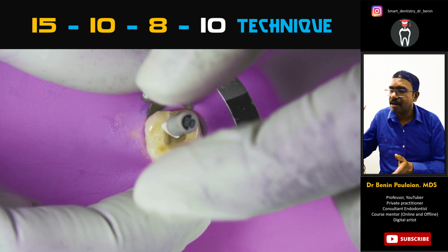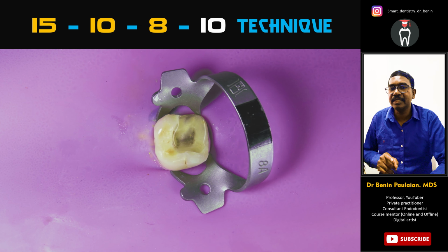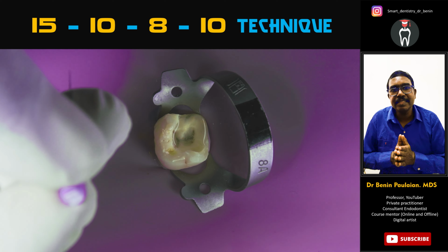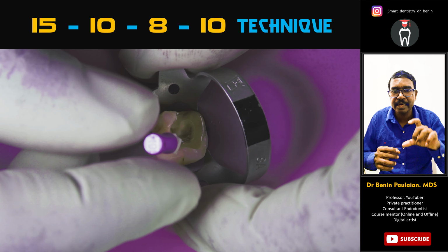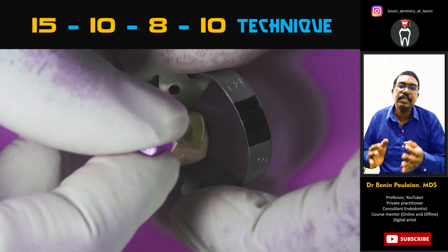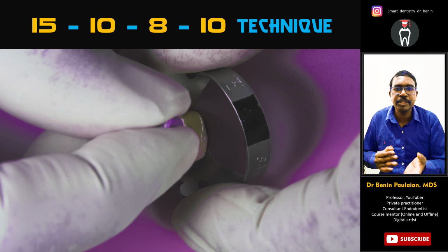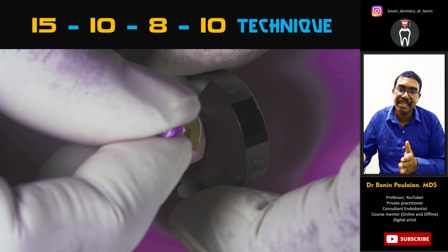So you can see that all the canals have been negotiated till the full length. Now what we are supposed to do is take a 10 size K file. You can use a little up and down motion or a pull and push stroke, and now you can negotiate or widen the canal which was already negotiated by the 8 size file, maybe to create a smooth pathway, and then you can take the working length, maybe the tentative working length.